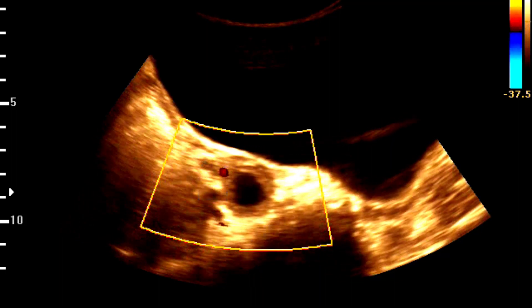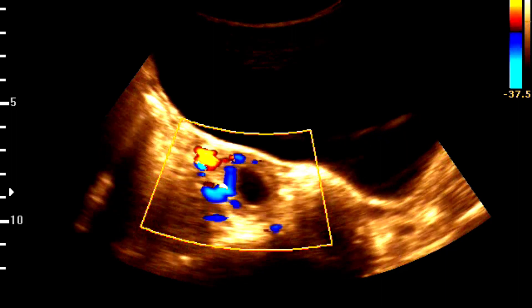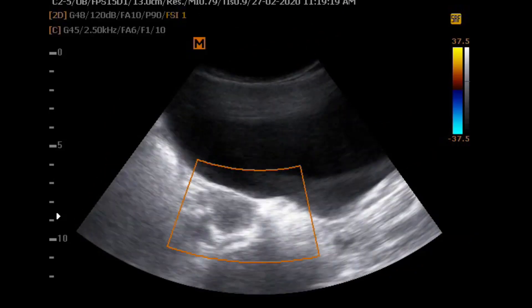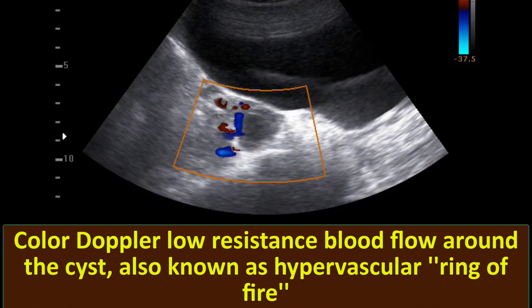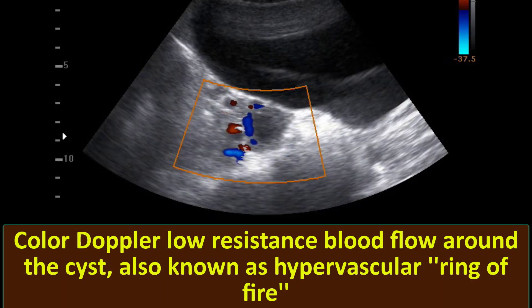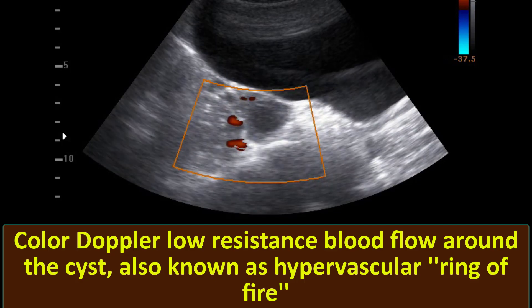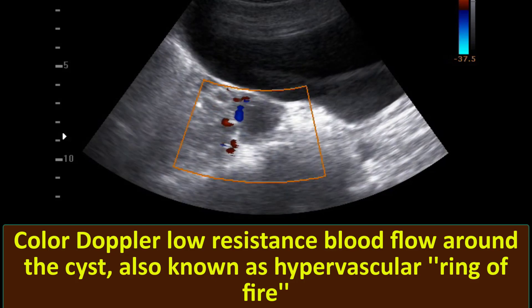If the cyst has been present for some time with complicating hemorrhage, a fine internal lace-like echo pattern may be seen. Colored Doppler shows either no vascularity within the cyst or shows low resistance blood flow around the cyst, also known as hypervascular ring of fire.